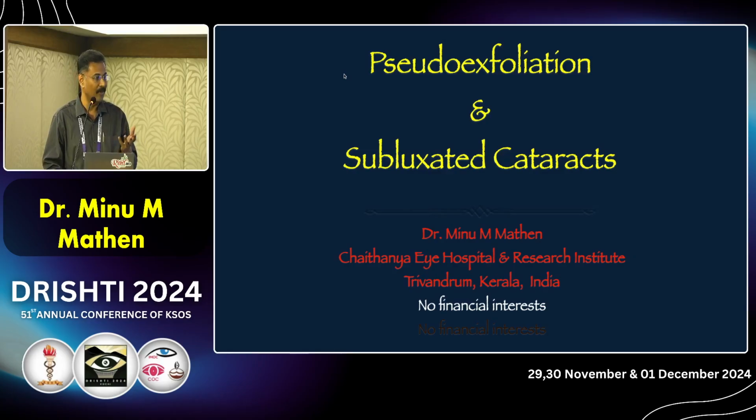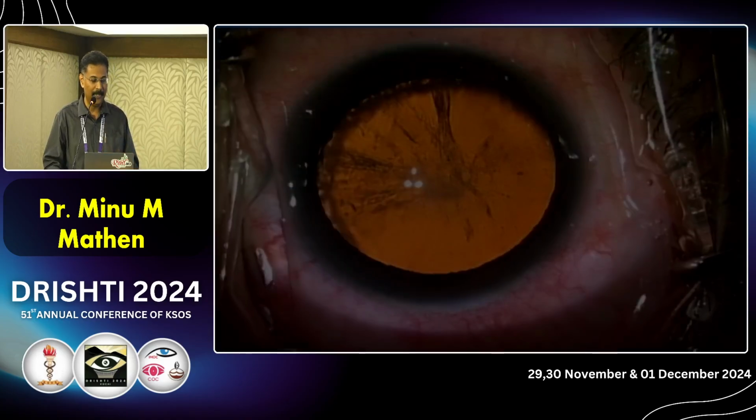We don't get subluxated cataracts very often, and every time I get a subluxated cataract I am scared because it is not a predictable thing. Each subluxation is different. The area of subluxation is different, the mobility is different, many things are different. So this is one of the most difficult cases to handle in phaco, is what I consider. That is why I find happiness in talking about this.